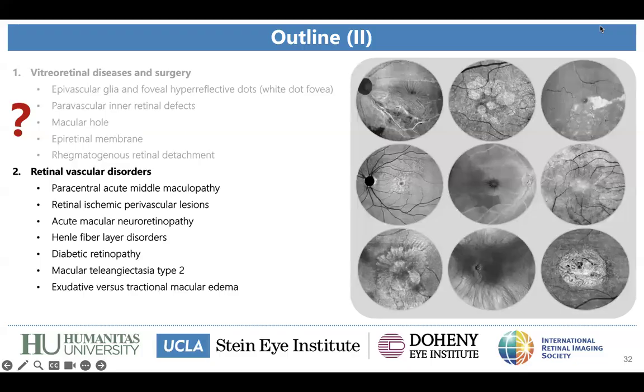images. My question to you is, do you use some OCTA segmentation? Do you prefer a specific segmentation? In your practice, is there any segmentation for a specific disease that you think is best to use in daily practice?